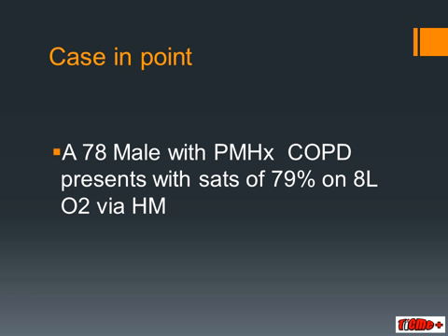Okay, so let's start with a case. You're in your emergency department when the ambulance turns up with a 78-year-old man with a past history of COPD. He's on 8 litres Hudson mask oxygen and has SATs of 79%.